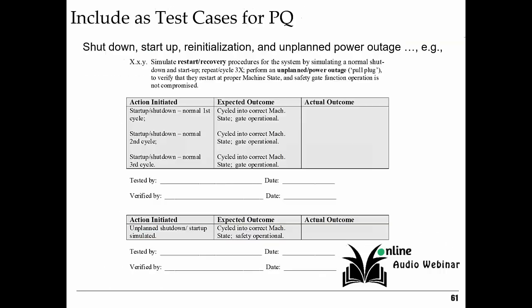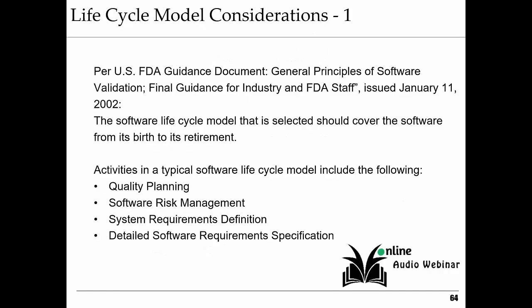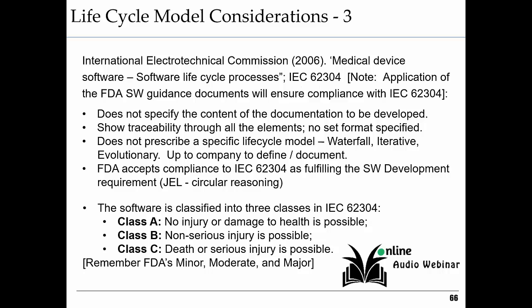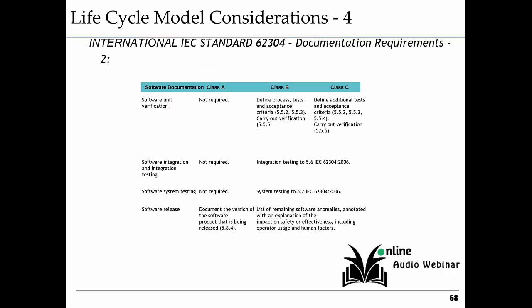Part 11 is for GMP compliance. And we mentioned the format, again, of the test. That's just a suggestion. There's no one way to do that. And this has to be done cradle to grave. You're responsible for the device and some of the considerations. I mentioned IEC 62304. There's an example of 62304, so the 2 pages dealing with 62304 summed up.